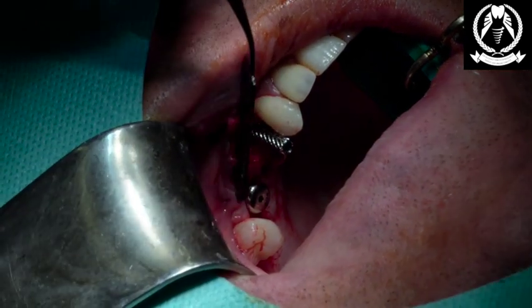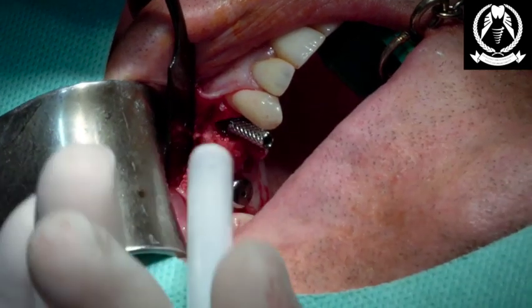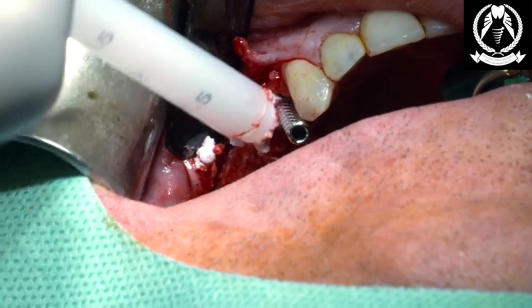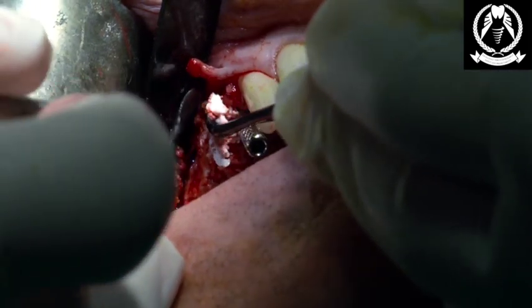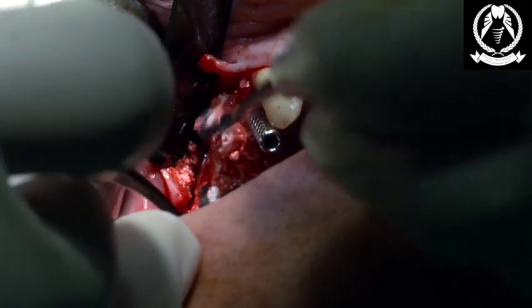followed by a little bit more ethos, which is the grafting material. Okay, I'm trying to get this totally in view. So this material I want to put in, can you grab that and put it into the socket please? Around there. So you can see this is filling the buccal gap, or otherwise known as the jump gap.